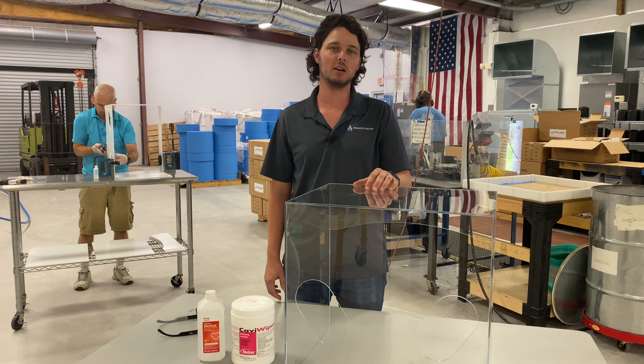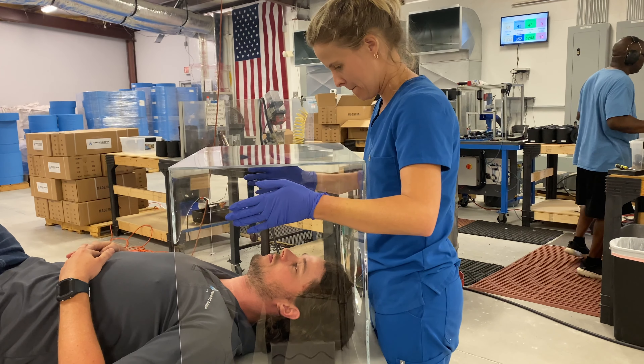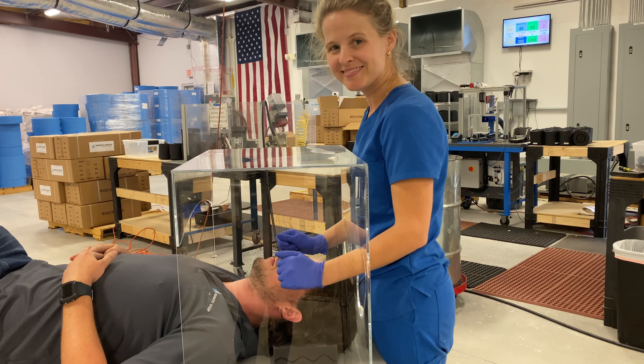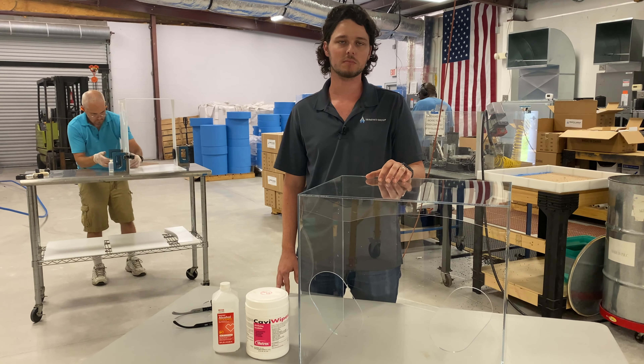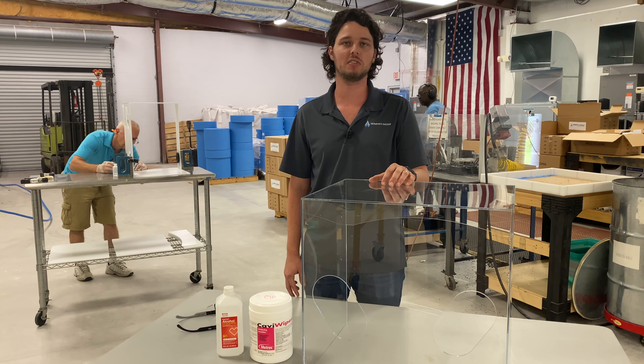Using an intubation box is simple. A nurse or doctor places the box over the patient. The doctor then places their arms through the holes to perform the intubation. Stretch wrap, saran wrap, or similar may be wrapped around the box to provide greater air sealing. When the intubation is complete, the box is removed to be sanitized for the next procedure.